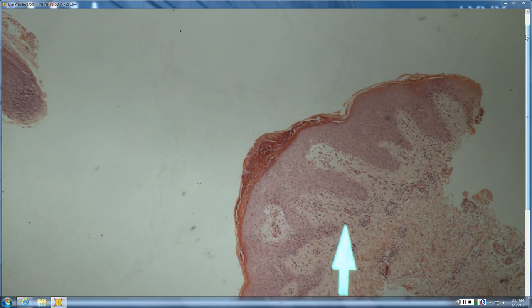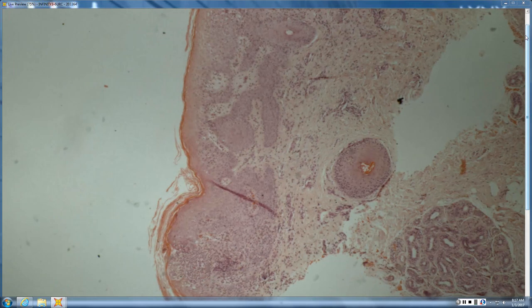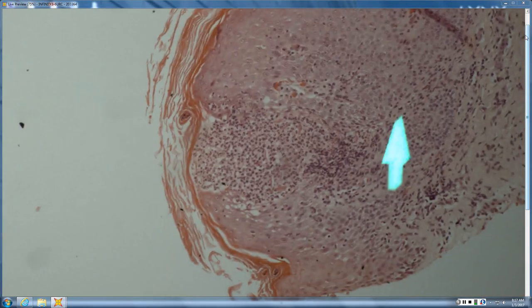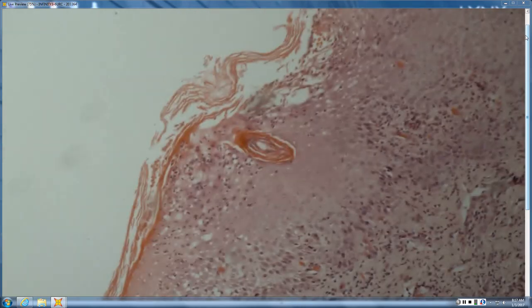Yeah, crust with neutrophils, like a crust, puts you in the category of? Well, Langerhans cell histiocytosis kind of gives a crust. And so LCH absolutely can give you an overlying crust. Also, it could just be a suppurative folliculitis. So, you know, looking for a Langerhans cell infiltrate, very, very smart thing to do. Good for you. And then just the suppurative inflammation in the follicle.